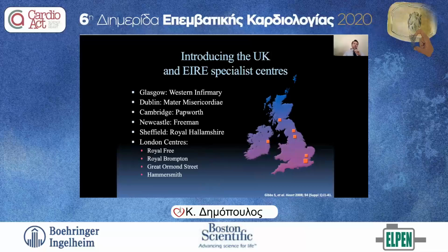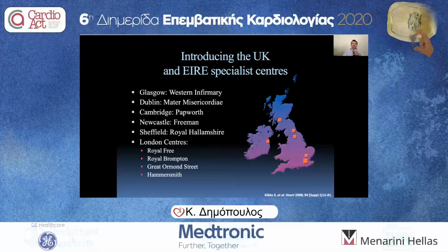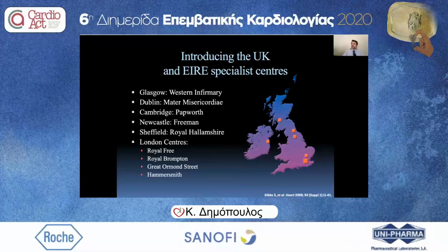Finally, again, it's important that right heart catheterization should be performed in expert centers who do enough numbers. We all know the theory, we all know how to do it, but doing it a lot is very important. Interpreting lots of these cases is very important. That's why in the UK we have only a few centers doing pulmonary hypertension, either in their centers, but also in large shared care centers in the network; those centers should be doing the right heart catheters.